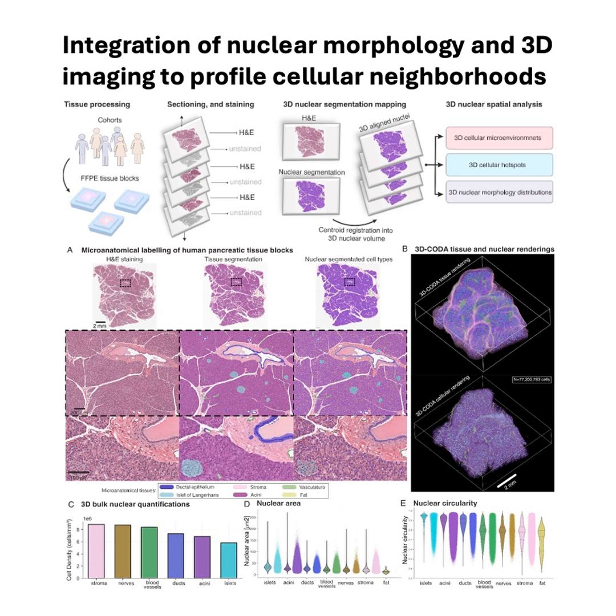Changes in these characteristics aren't just superficial tweaks. They often reflect really profound underlying changes. Genetic, epigenetic, even things happening in the microenvironment around the cell, all related to disease. So it's like reading the expression on the cell's face. That's a great analogy. A healthy nucleus tends to look a certain way, but a diseased one might be stretched out or swollen or just dramatically misshapen. These subtle changes aren't just random noise, they're vital clues.